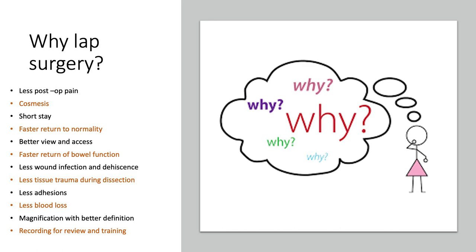You can't compare an open surgery with laparoscopy where you can have a magnified and a closer view to the pathology. Faster return to bowel function, less wound infection and dehiscence, less tissue trauma during dissection, less adhesions, obviously less blood loss, although you will see it magnified, but it will be less if you follow the principles. Magnification with better definition, and remember, these are surgeries that can be recorded for review to see how you're doing or how the surgery was done and for training purposes.